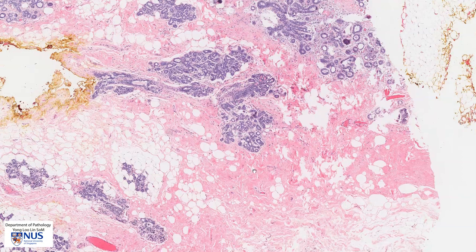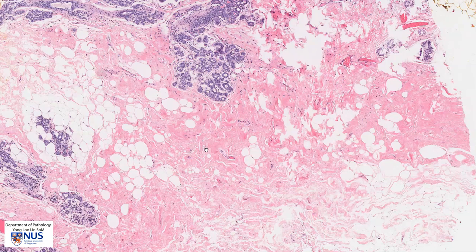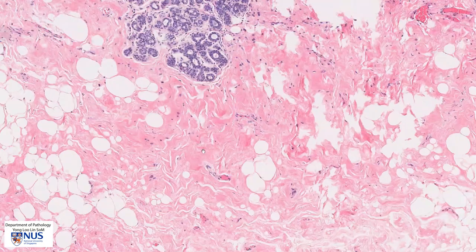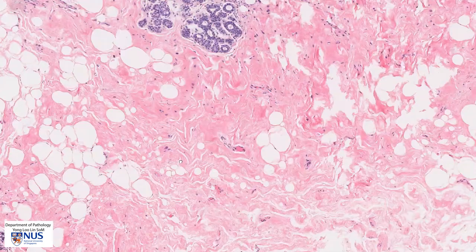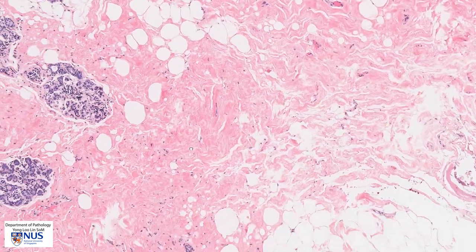Here are the areas of stromal sclerosis, which is essentially collagen, and this contributes to the firm texture of the breast on palpation.